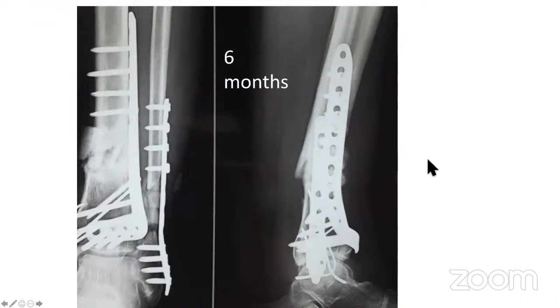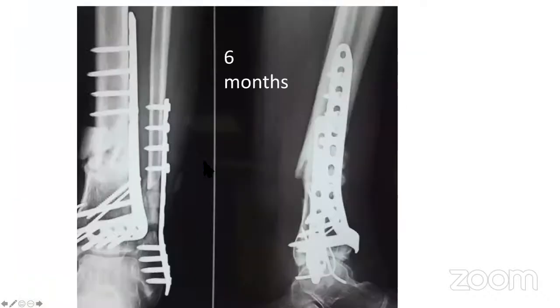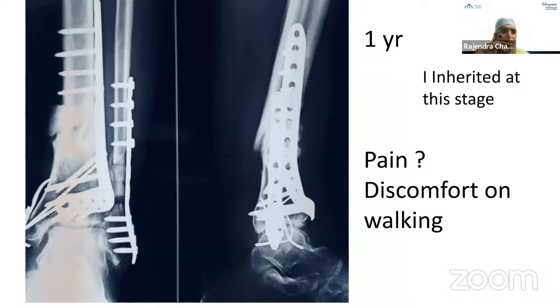You haven't seen this case, though? No, I have not seen. But then why do you see that radiologically there are no gaps seen? The radiology appears as if things are improving. No, sir. That is because of the radiological illusion. If you see the posterior view of this picture, you will find that there is some problem. Whatever is seen anteriorly is a woolly callus, because of the comminuted fracture, they are trying to heal, but there is no complete healing. Whenever there is a pain, it means the pain is arising from the ankle or from the non-union site. Perfect. So is it bone substitute there? Yeah, I think this is what it will be.